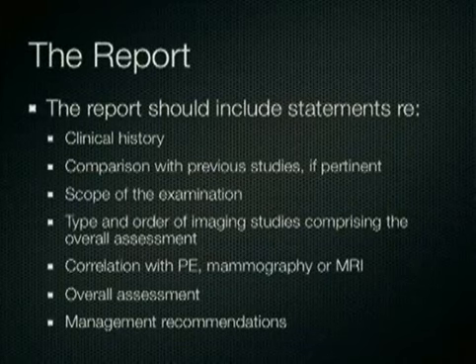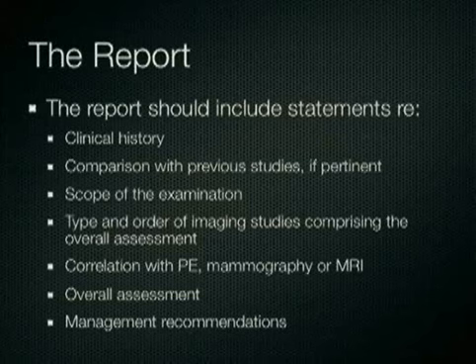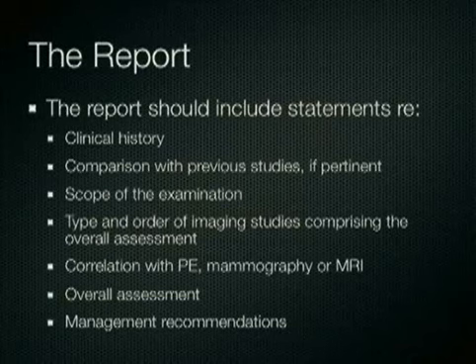The BIRADS lexicon includes not only description of the features of masses and appropriate terms to be used to describe these features, but also comments on how these terms should be used to generate a final assessment and management recommendation.